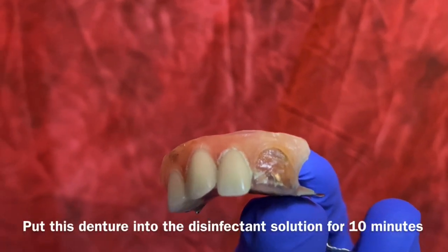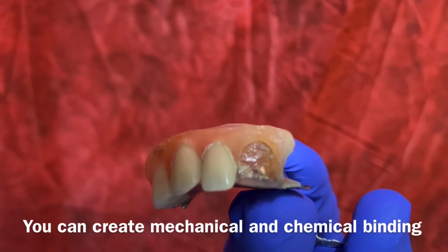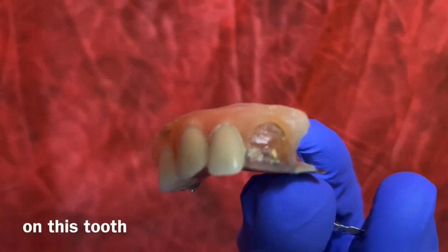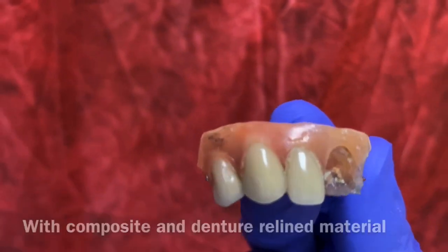Put this denture in disinfectant for 10 minutes, take it out, and you can create mechanical and chemical bonding on this tooth with a composite material or denture repair material.